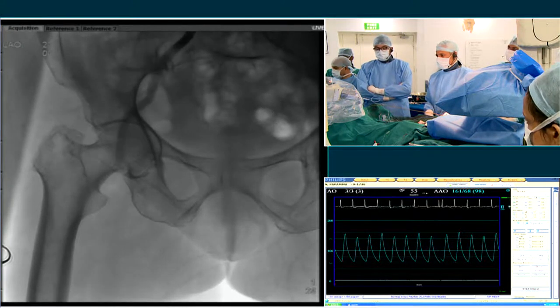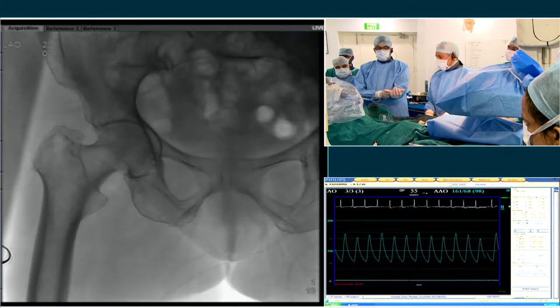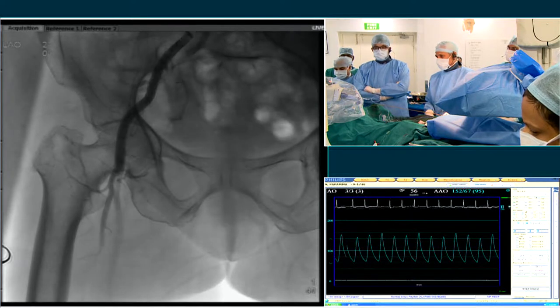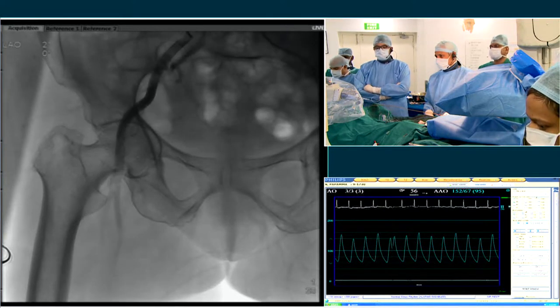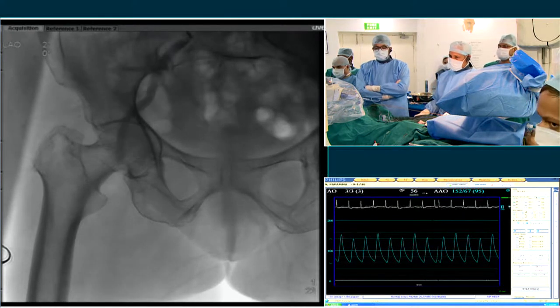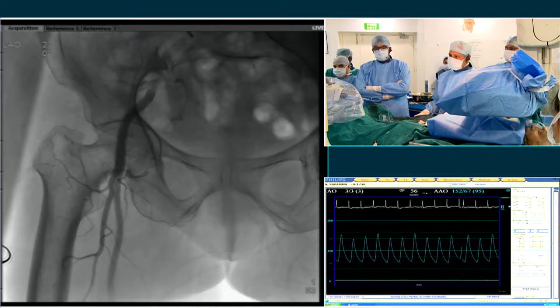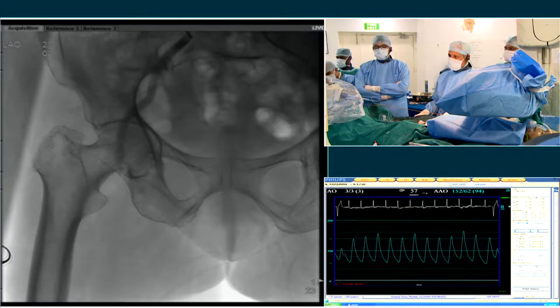Sure. One of the challenges we look for, so balloon expandable, what are the trade-offs? One of the advantages of balloon expandable is a very predictable deployment. It has a lower pacemaker rate than we've seen with self-expanding valves. But some of the trade-offs are in eccentric calcium and LVOT calcium, a potential risk. And if it's LVOT calcium, it's annular rupture.